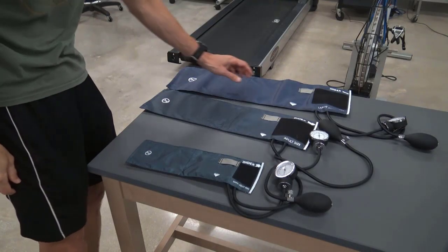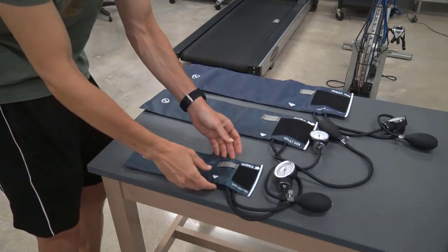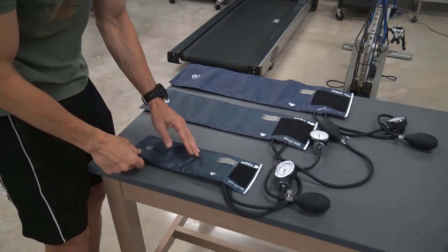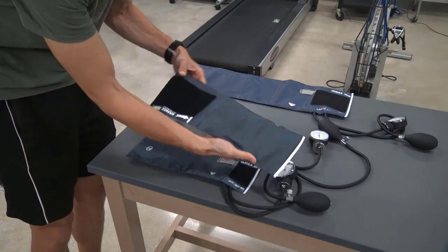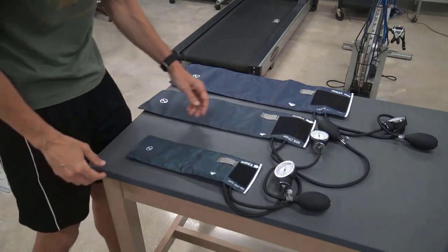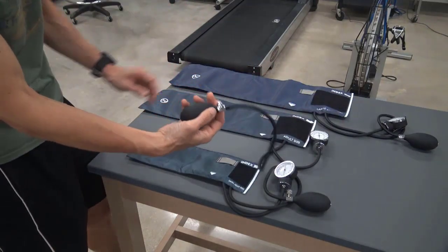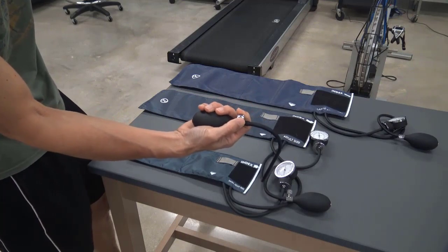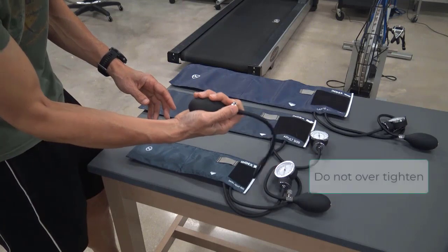Blood pressure cuffs come in all different sizes — here we have a small, medium, and large — and the sizes are typically noted on the cuff. In choosing the proper size, about 80% of the cuff bladder should cover the arm. The bladder is the inflatable portion of the cuff. Too large of a bladder will underestimate and too small of a bladder will overestimate one's blood pressure. From the cuff, we have tubing that connects to the inflation bulb and air release valve. To control the flow of air when inflating the cuff, you turn it to the right (clockwise), and to release the air, turn it to the left (counterclockwise).